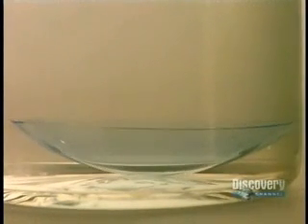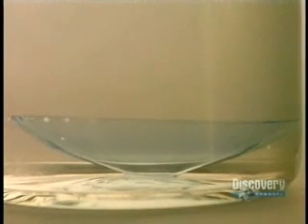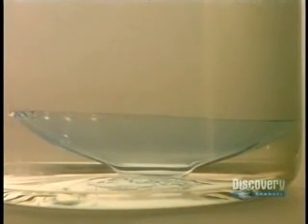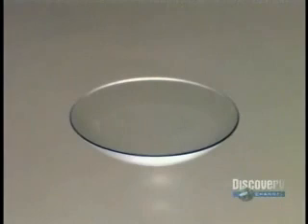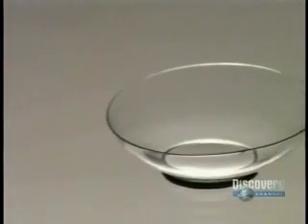The polymer is hydrated to make it flexible. Lenses remain immersed in a balanced pH saline solution for 24 hours. The lens becomes engorged with liquid and expands, reaching the desired proportions.